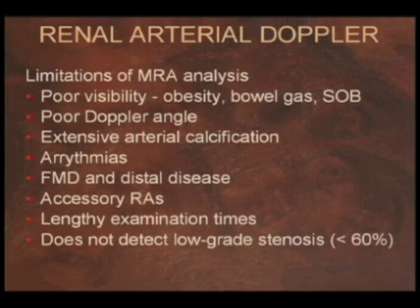Cardiac arrhythmias can affect your Doppler waveform. Fibromuscular dysplasia and distal atherosclerotic lesions are more difficult to detect because they're not in the proximal renal artery. Accessory renal arteries are common and difficult to detect with sonography.